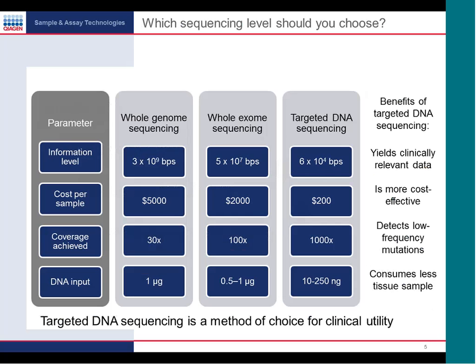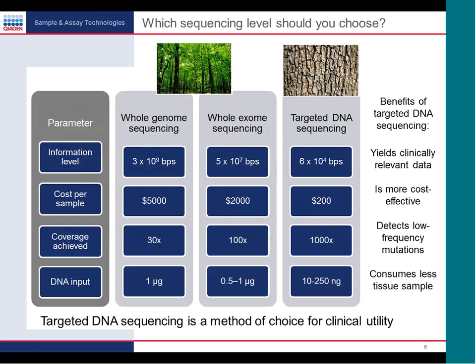However, if we look into DNA next-gen sequencing, there are three different flavors. One can go for whole genome sequencing, whole exome sequencing, or targeted DNA sequencing. Which of these is best for clinical utility depends on what you are looking at. But as an analogy, whole genome or whole exome sequencing is more of a high-level view, whereas targeted DNA sequencing is a more detailed, more granular view of anything you are looking at.